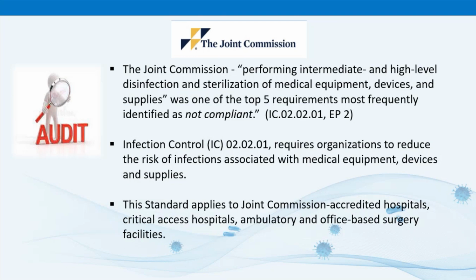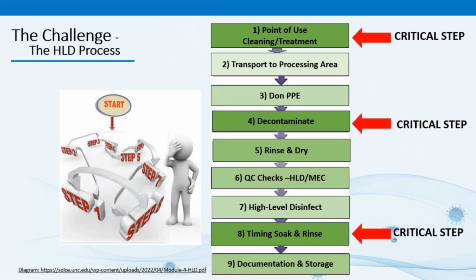Let's look at a few more findings from another survey organization, Cordemache and Associates. Now, the HLD process itself is a challenge due to the many opportunities where its multiple steps have more steps within those steps. Multiple failures were observed by surveyors.